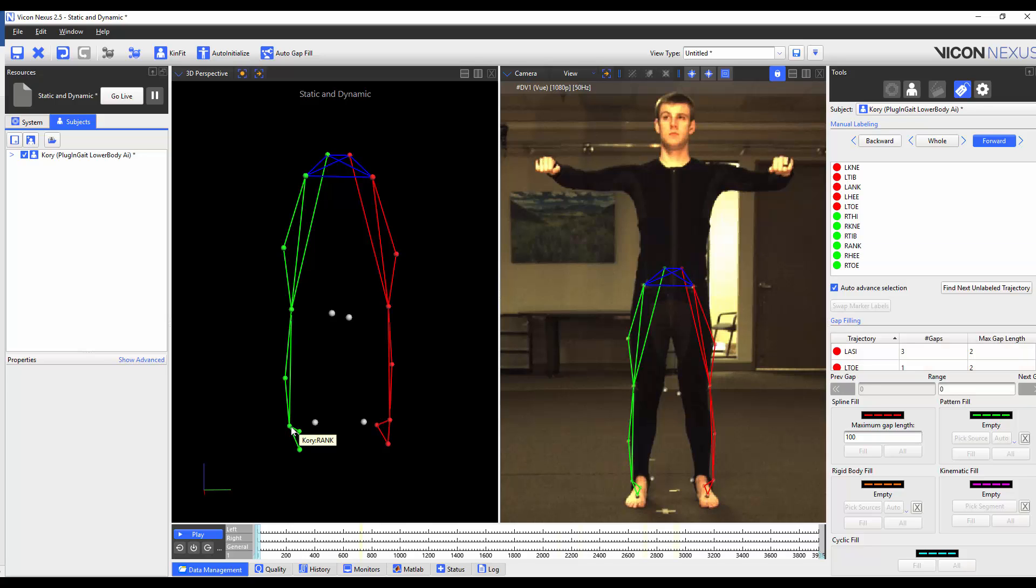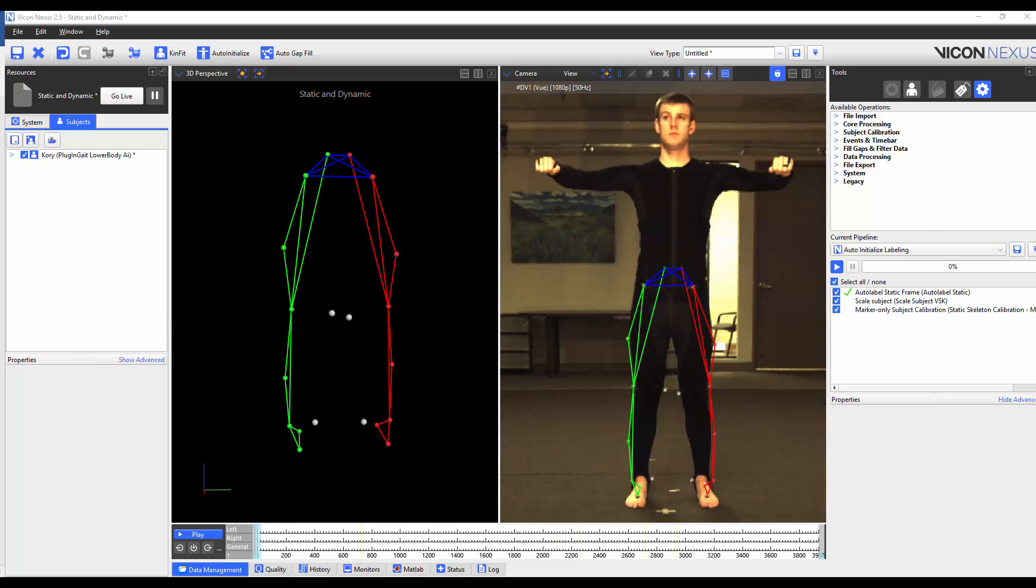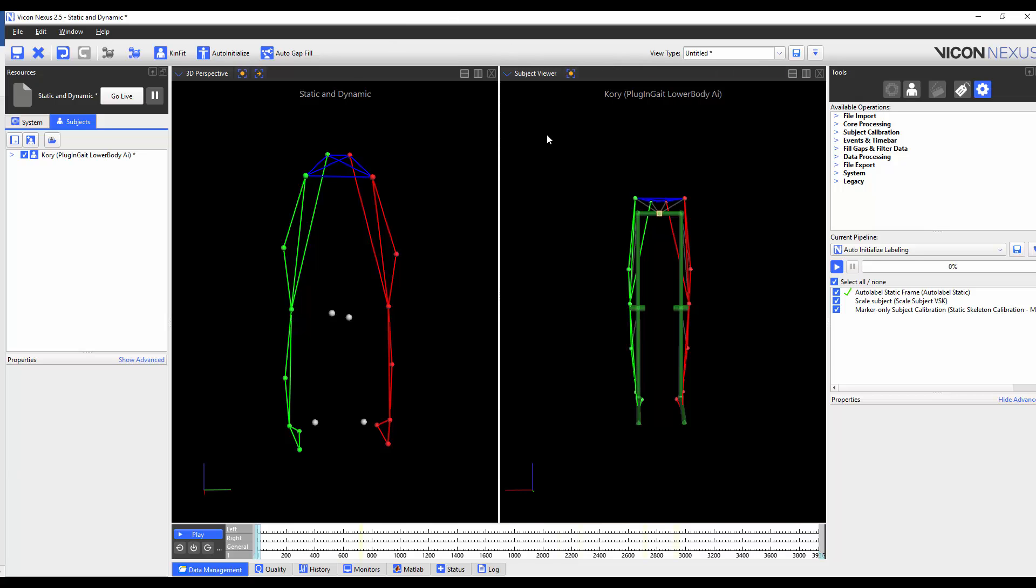Step 2 is to scale the subject VSK. This will scale the segments of the VSK to make the segment lengths of the subject. To illustrate this I'm going to load the Subject Viewer. When I run this operation, you will notice that the model will resize accordingly to match the size of my subject.